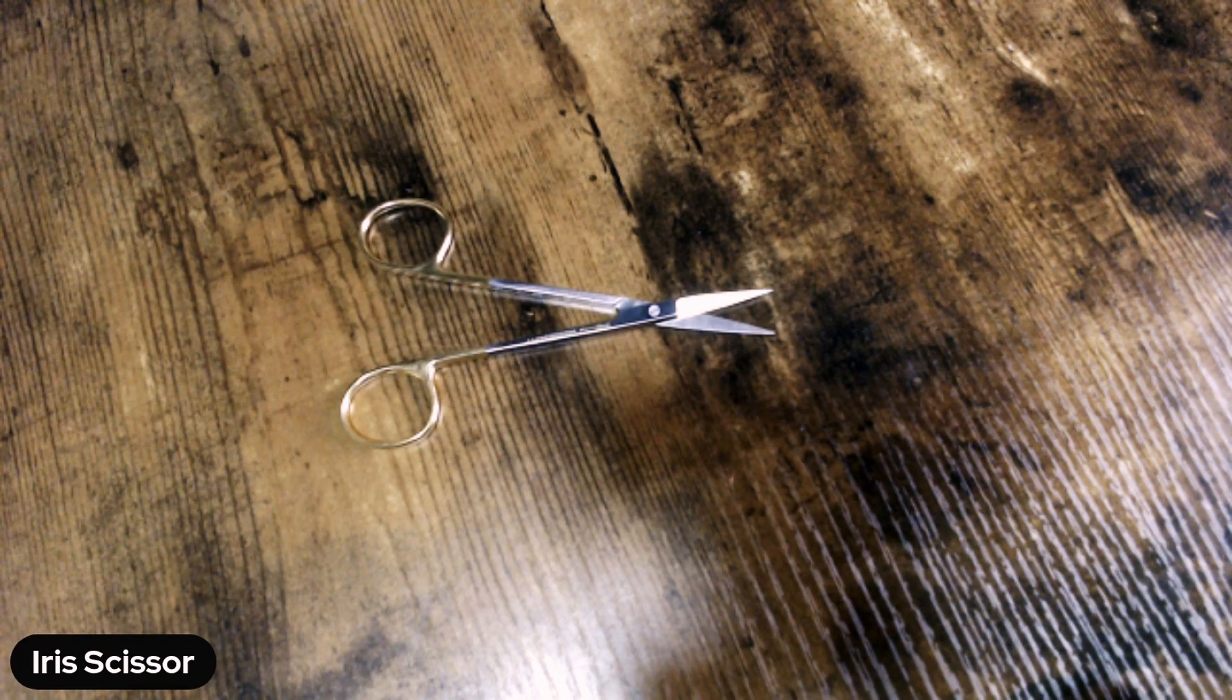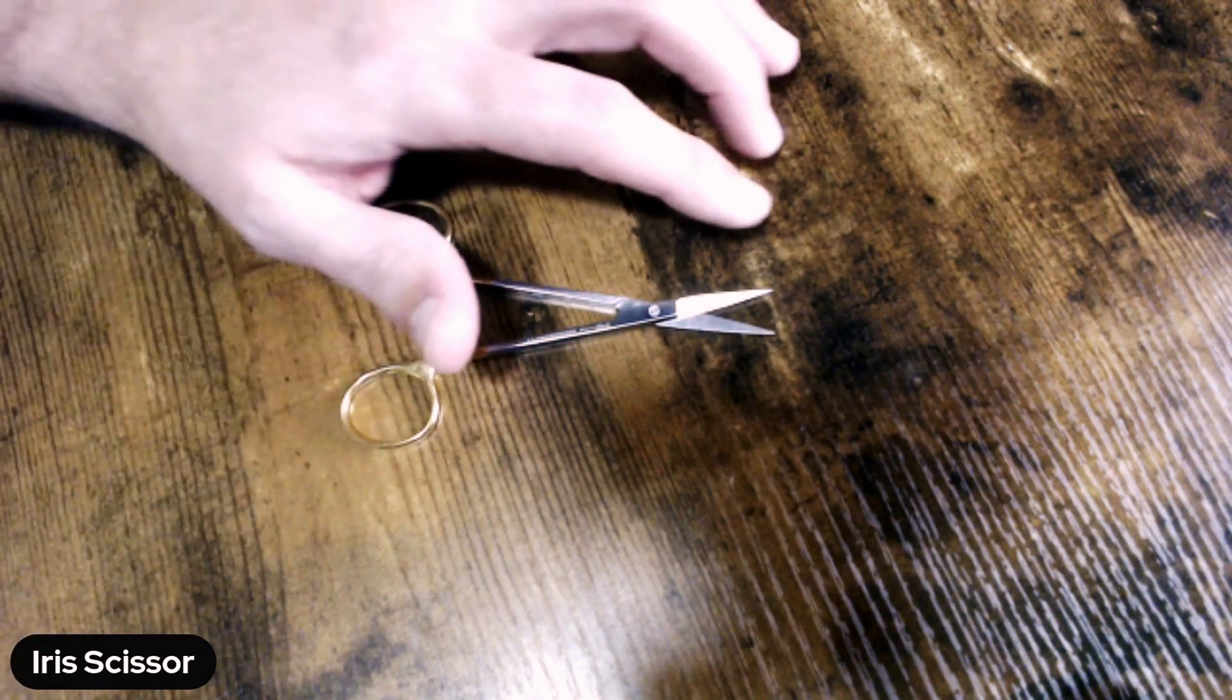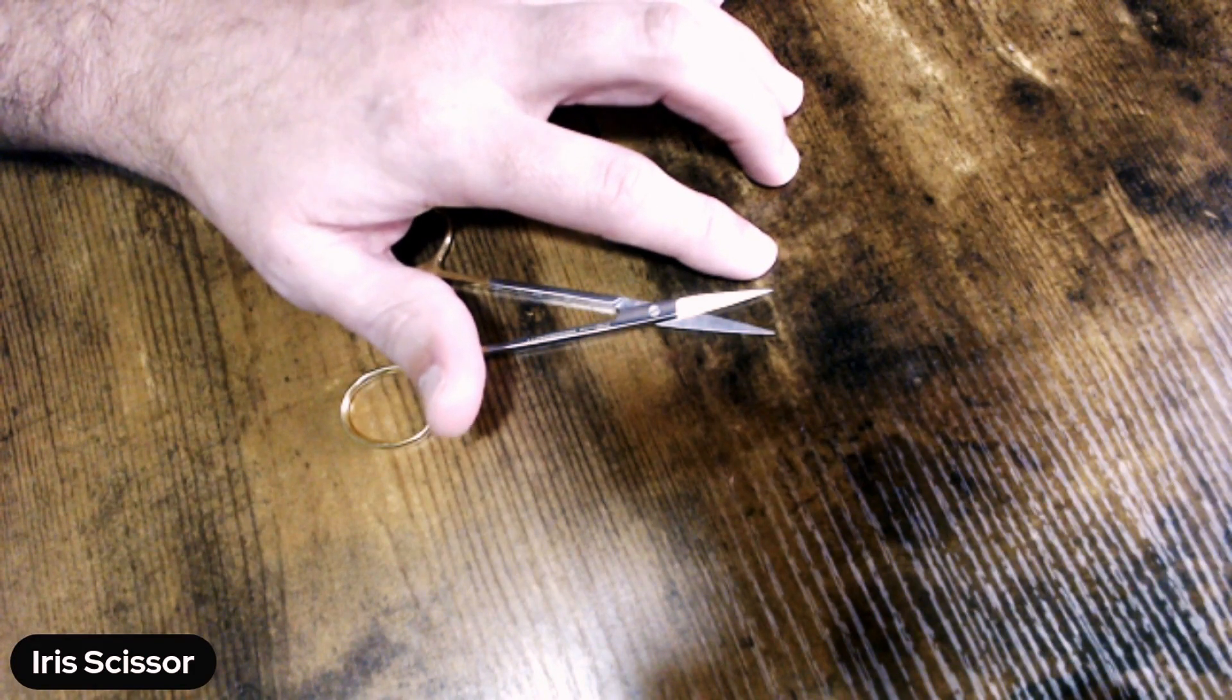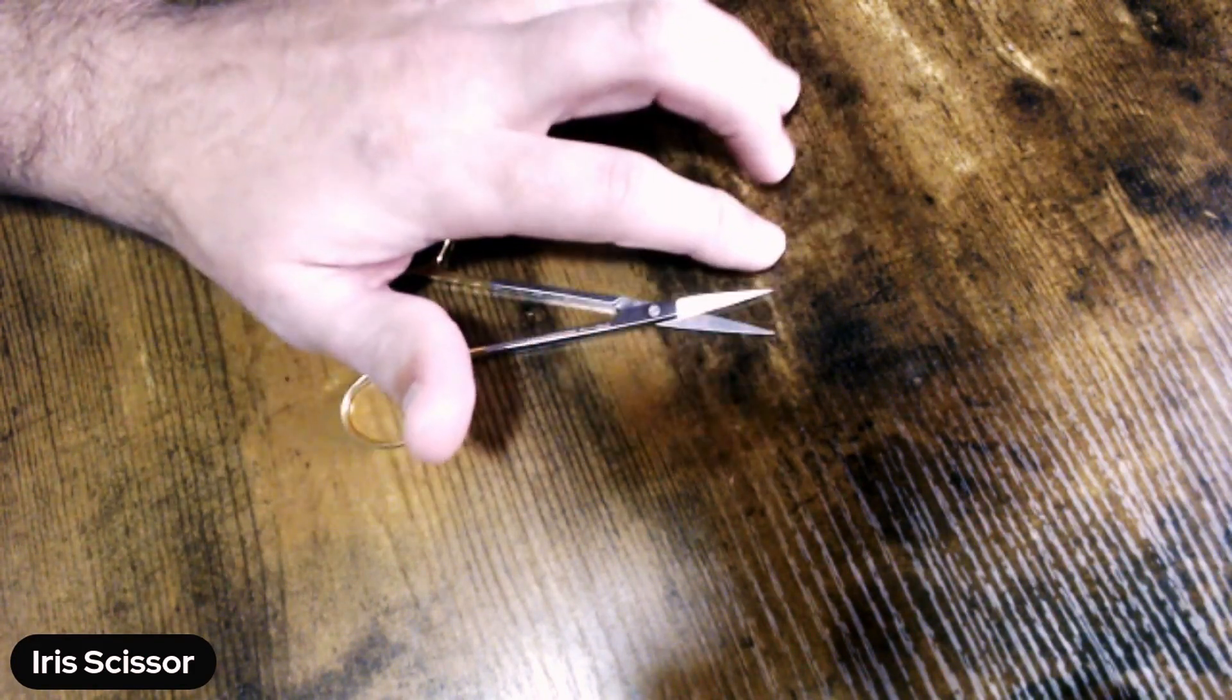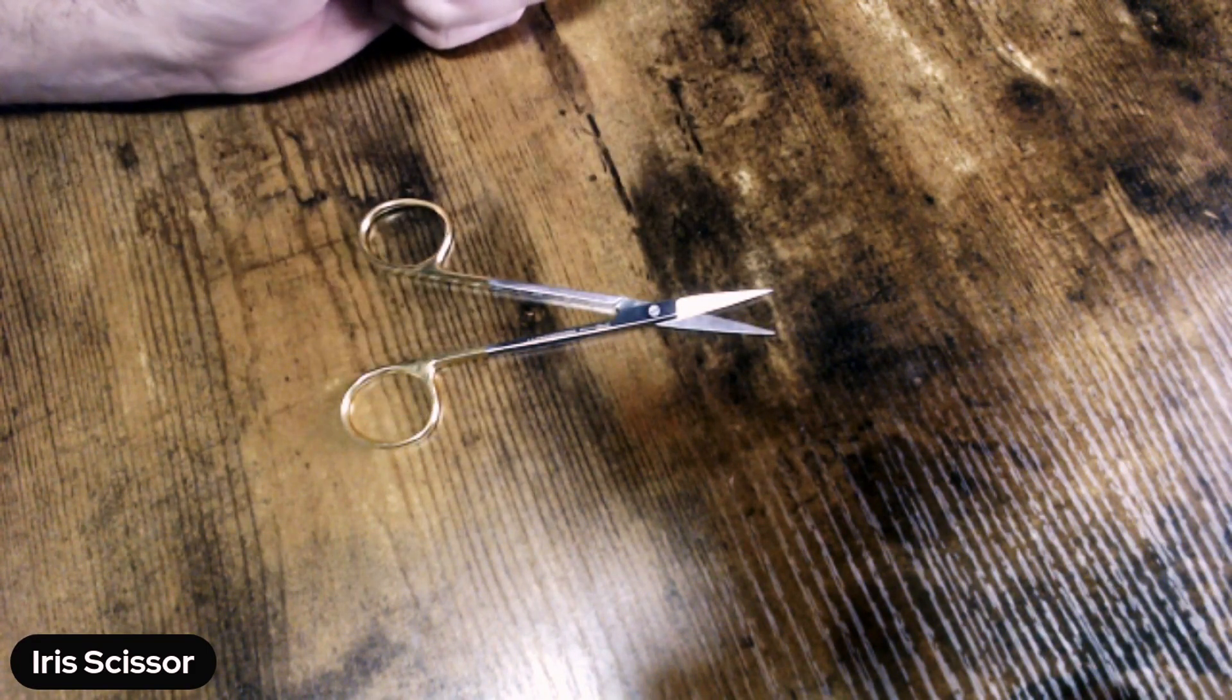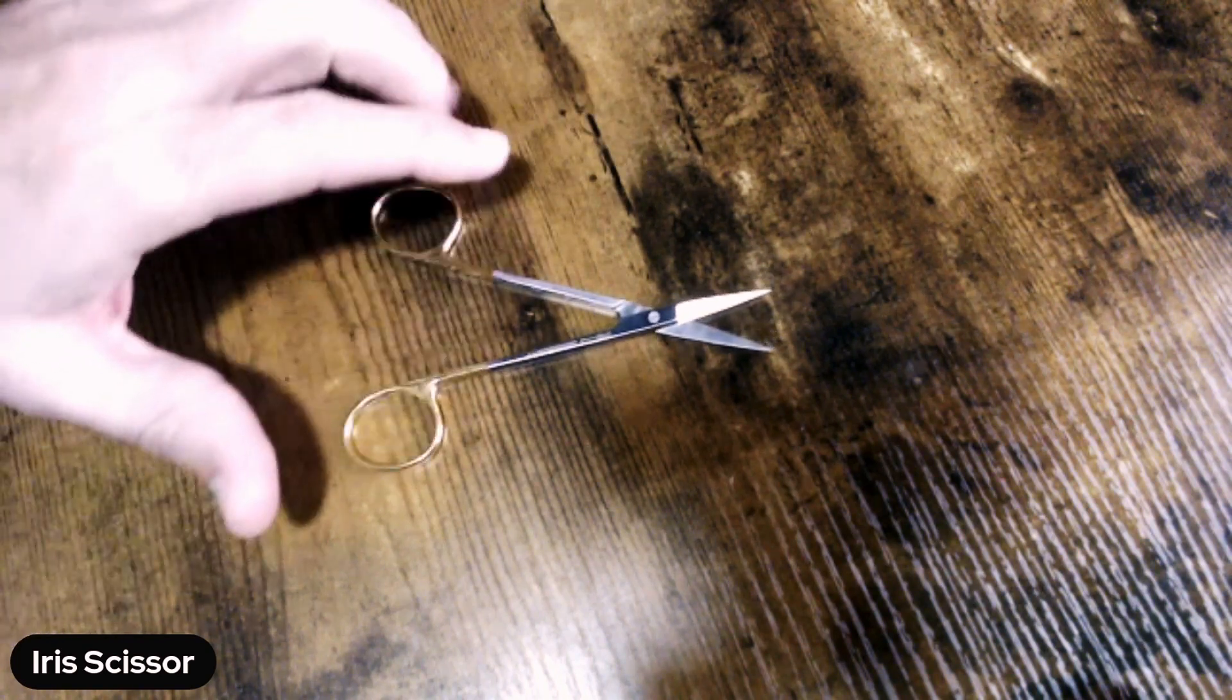As I mentioned in the intro, this particular iris scissor is a sharp-sharp. That's telling you that both of your blades have a sharp tip. Okay, as you're inspecting, keep close in mind obviously if the action has a smooth action up and down.